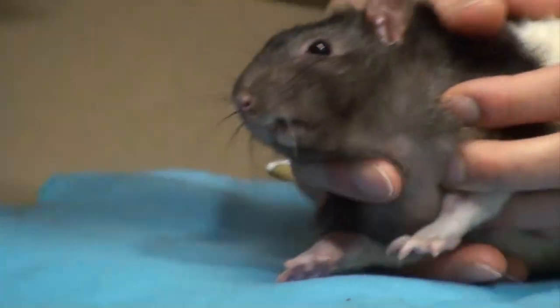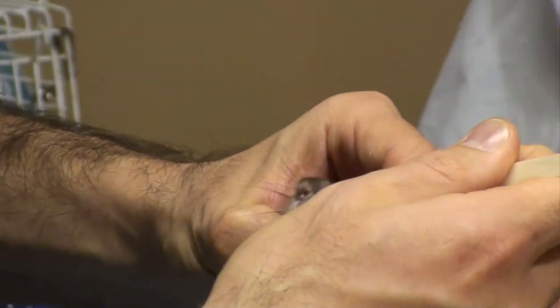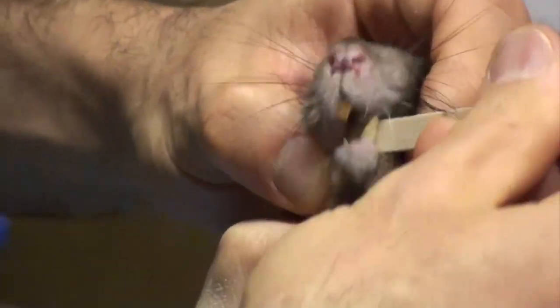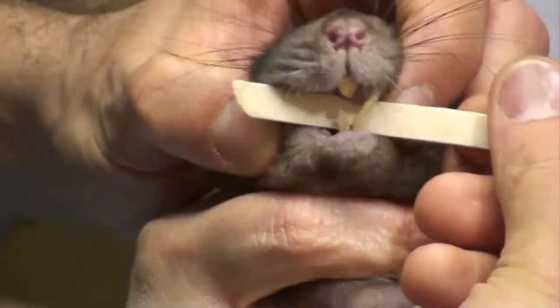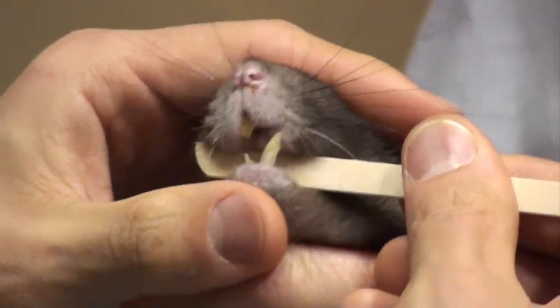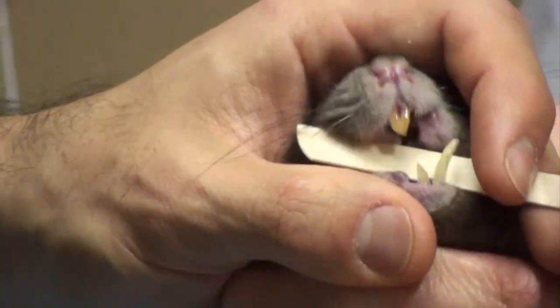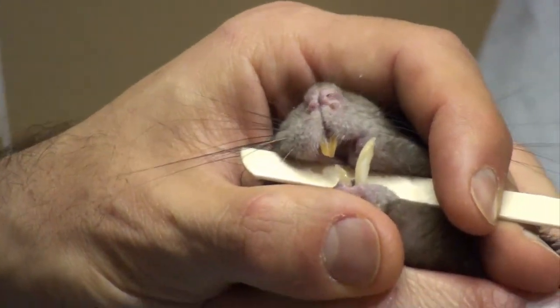We're going to trim his teeth now. Jen is going to hold him, and I'm going to slide the tongue depressor into his mouth behind the teeth so that the teeth are isolated and all other tissues are pushed out of the way. Gently holding the mouth closed keeps the tongue depressor in place so you don't have to worry about hitting any other tissues.